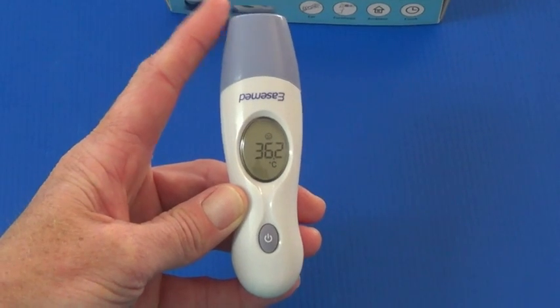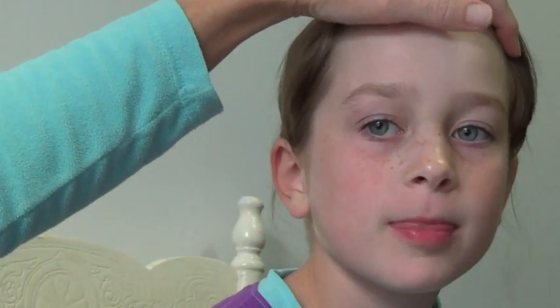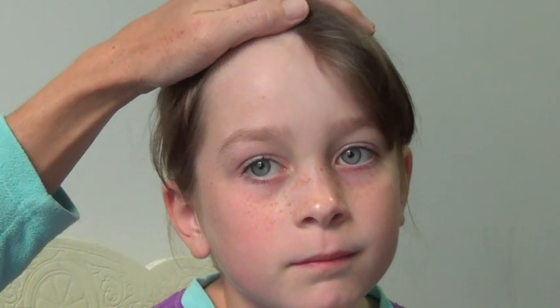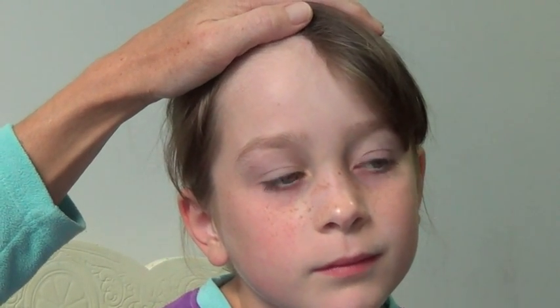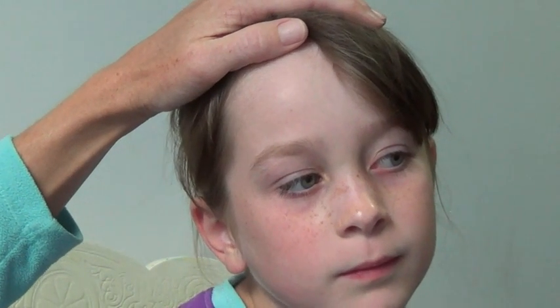As you can see the cap is still on. Just make sure when taking forehead temperatures you will need to fix the forehead hair out of the way, as this will create deviations in the measurements. Any sweat on the head or cosmetics can also affect the accuracy of the measurement, so just ensure you clean the forehead prior to measuring. It is also normal that there may be a temperature difference depending on various skin types and colour.